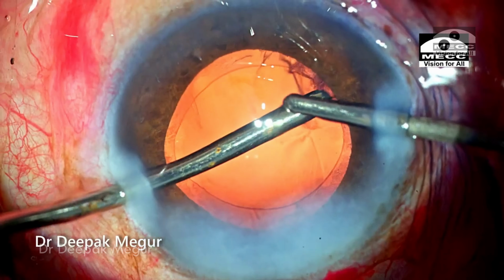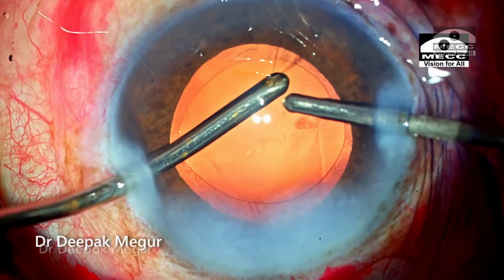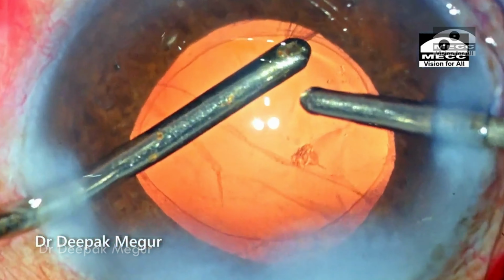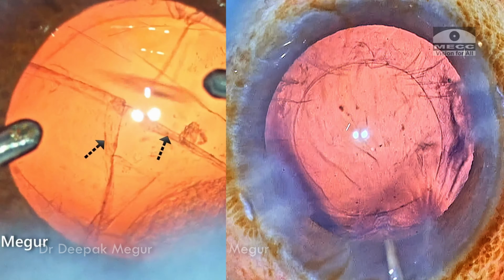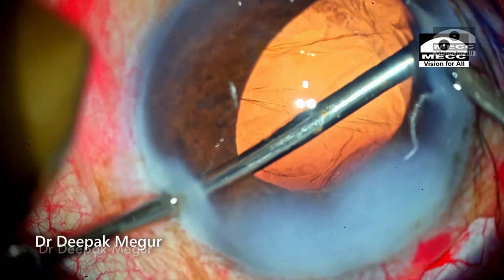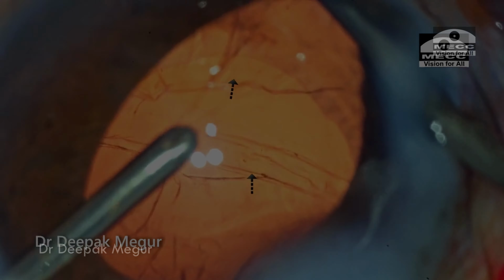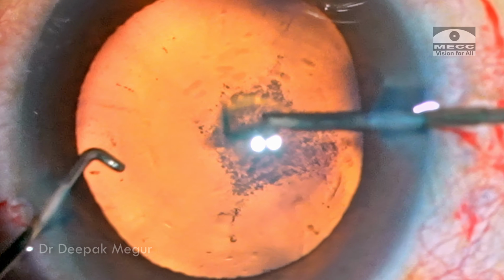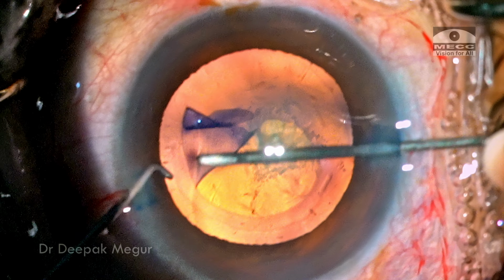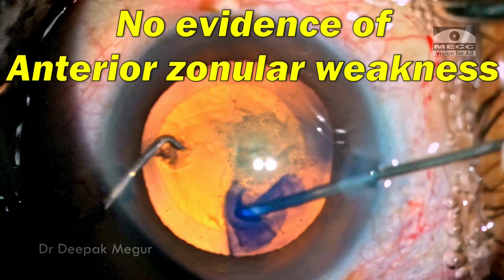However, when there is an isolated posterior zonular weakness, we can see that that particular quadrant of the posterior capsule becomes extremely thin, and the posterior capsule trampolines, and it tries to come in and get aspirated into the aspiration port. So we rewind the case and see, when I puncture the anterior capsule, there is no radiating fold, and tearing of the capsule is also quite easy. So there is no evidence of any anterior zonular weakness.